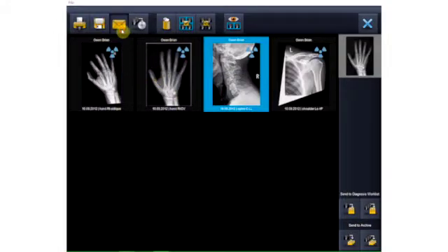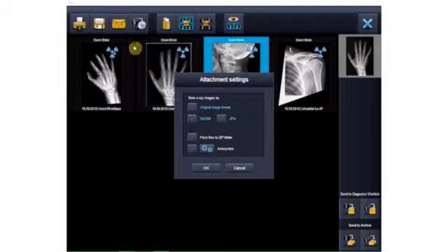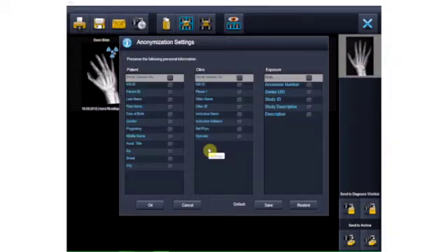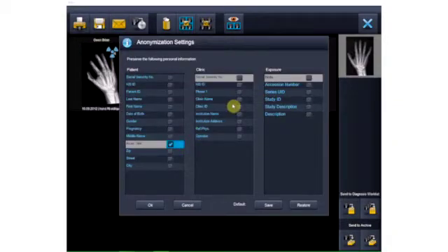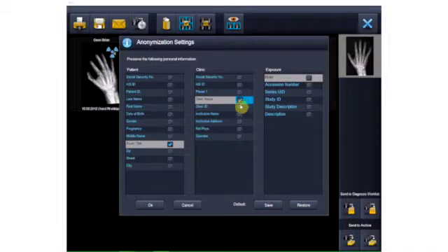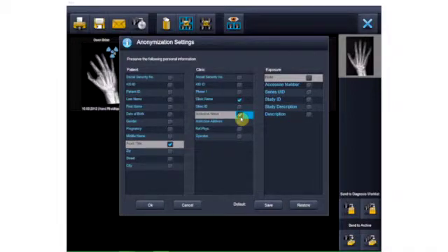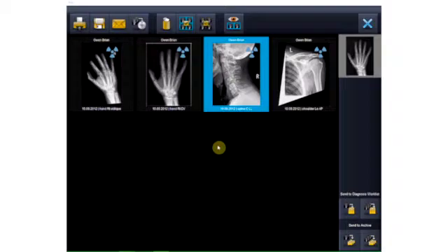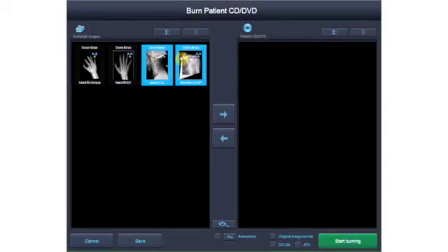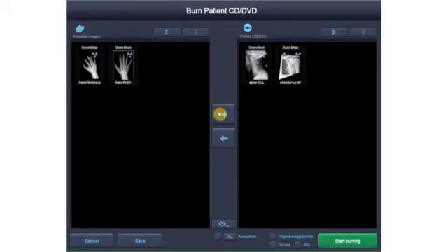You can send the images by email directly from the Examion AQS software, and here too you can anonymize the images. All the data you select and mark are noted on the image. You can also anonymize the images and burn them to CD or DVD in the desired format — a quick and intuitive procedure.